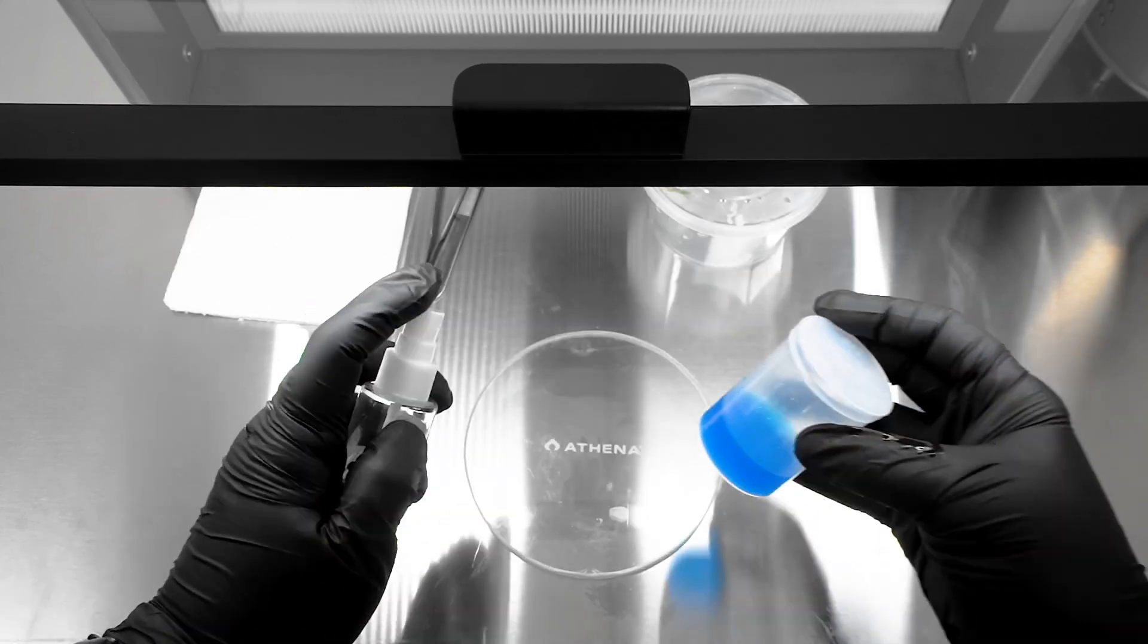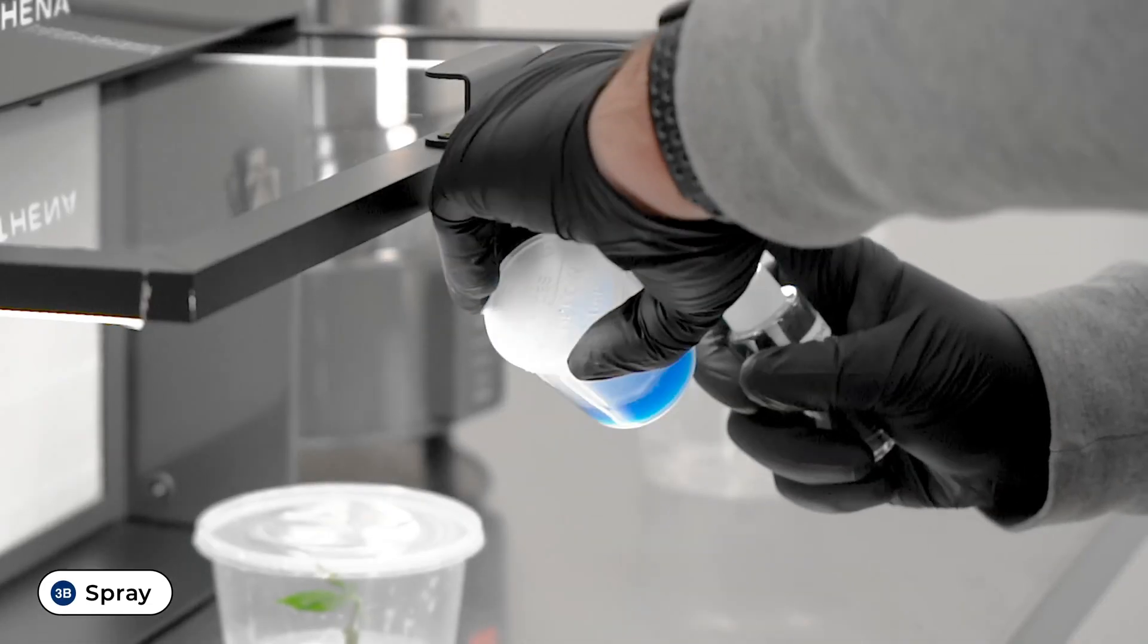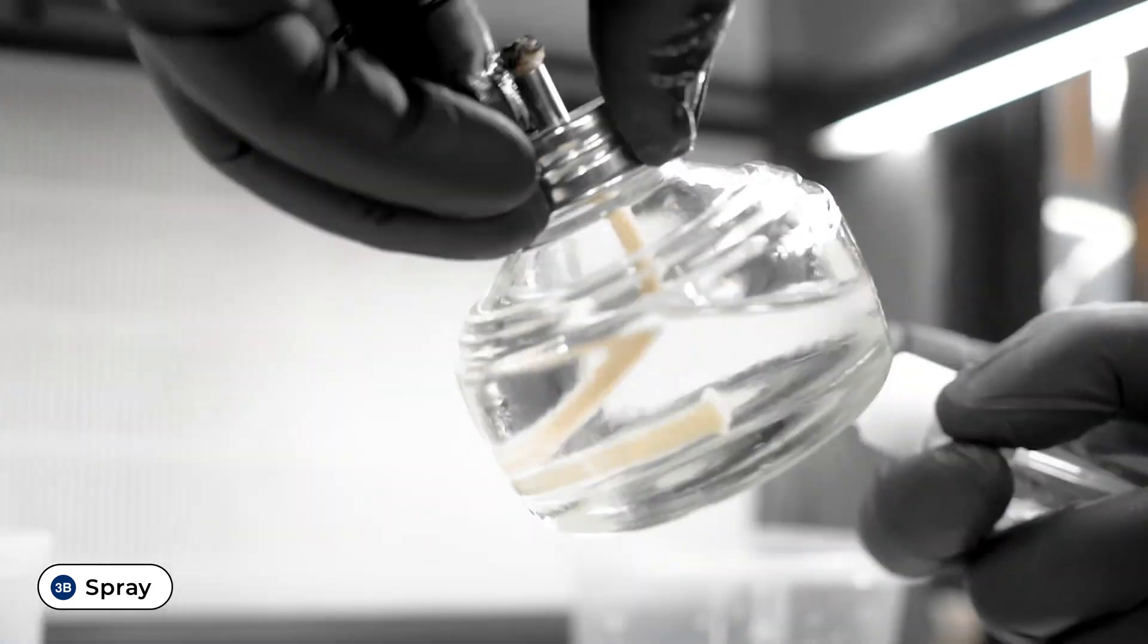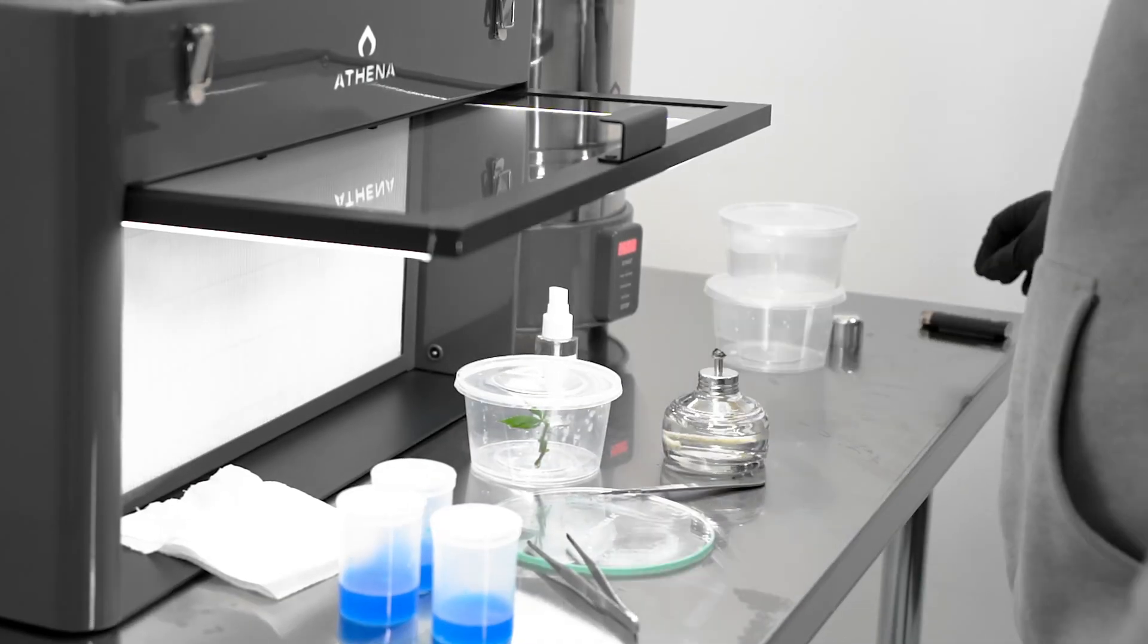Re-clean and sterilize the work zone with alcohol wipes. Spray the culture vessels and alcohol burner with alcohol to surface sterilize before placing in the work zone.